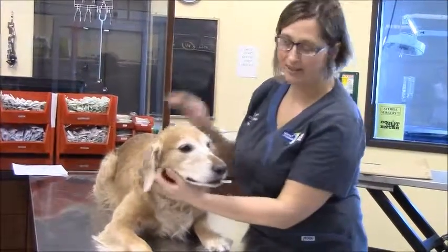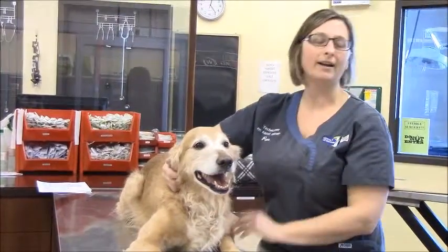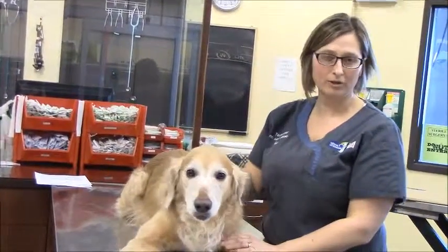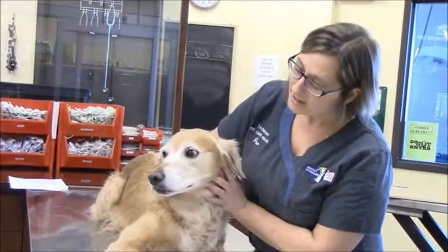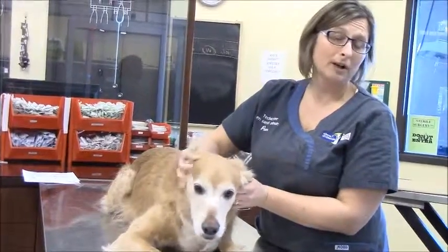Hi, my name is Pam. I'm one of the technicians here at Animal 911. Today what we're going to be doing is showing you dental cleaning from beginning to the end. Here I have Mrs. Ruby. Ruby is a nine-year-old golden retriever who had her teeth done approximately four years ago. The owners do brush her teeth occasionally and she's also on a dental diet, which really helps prevent tartar buildup on the teeth. She does have stage two dental disease in her mouth, and that's why we are doing her teeth today.